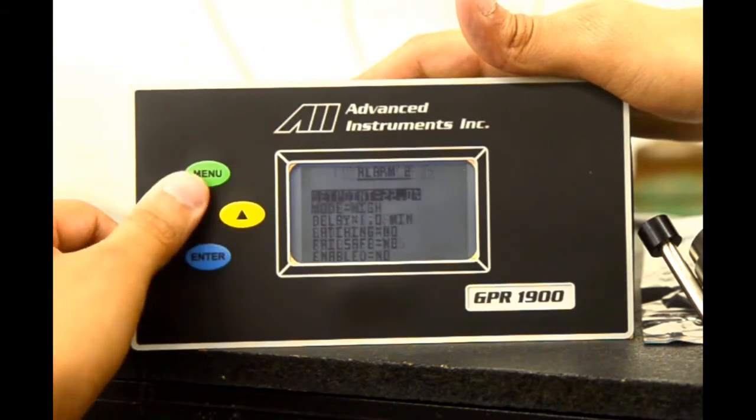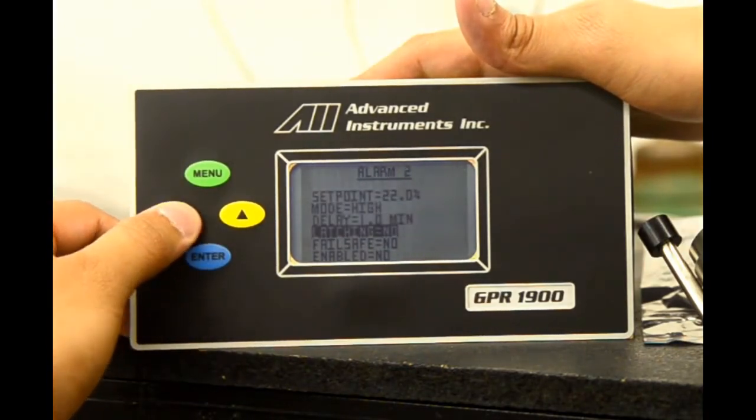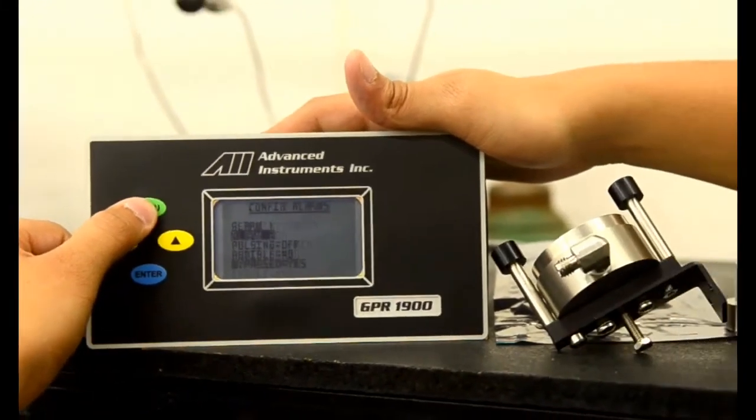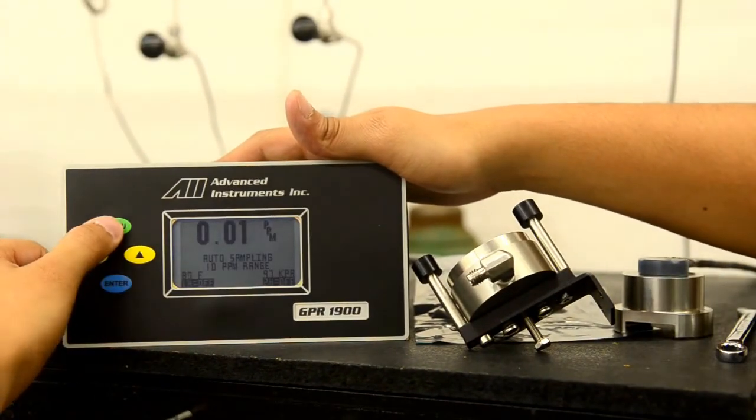We can configure alarm two in the same manner with the set point, mode, delay, latching, failsafe, and enabled options. We'll go back to the main menu. And you can see the alarm values are set at the bottom of the screen.